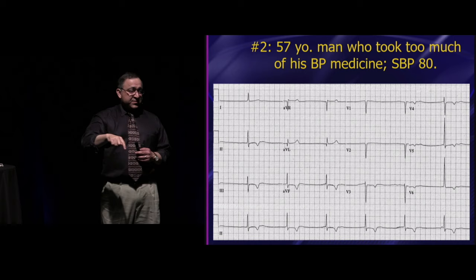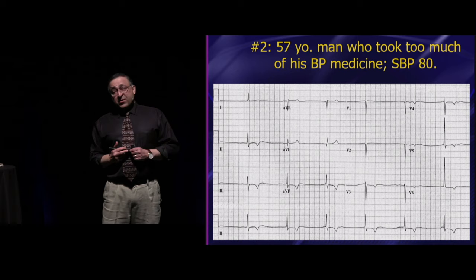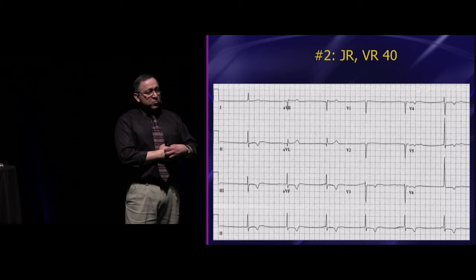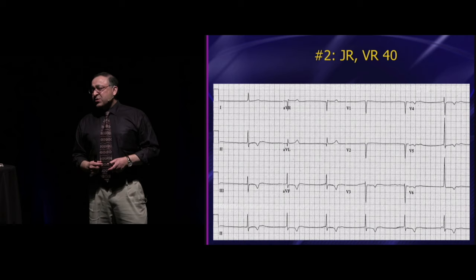Now, is this an unstable bradycardia? Is the rate too slow? Yeah, it is. It's a pretty darn slow rate, right? Ventricular rate's 40. So this is an unstable bradycardia, I think, that we would want to treat. And typically for a junctional escape rhythm, this is something that you can use atropine for. All right, narrow QRS, you can use atropine.